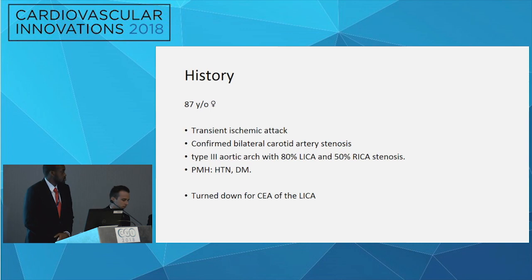But before we go on, I just wanted to preface this by saying that in our particular region, management of type 3 aortic arch can be challenging. Accessing the internal carotid via the type 3 aortic arch is often challenging for the interventionalists. So we'll be presenting on a novel method to facilitate that access. So on to the case.